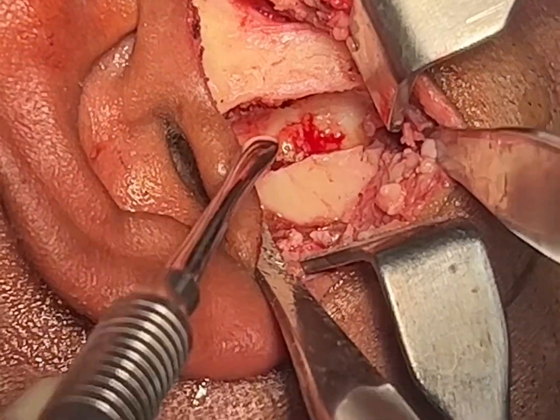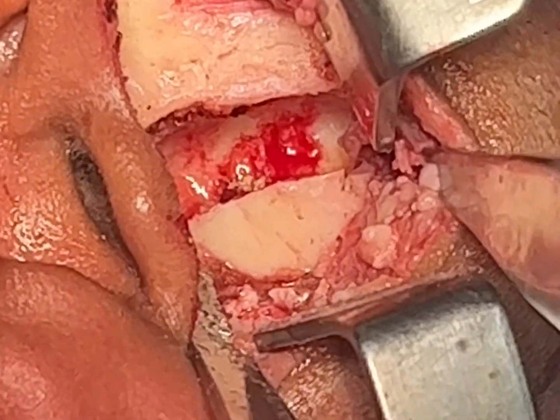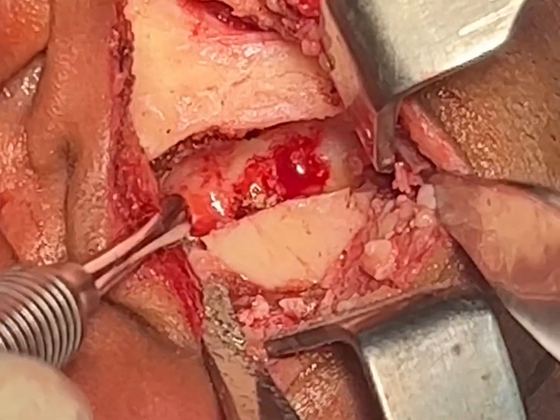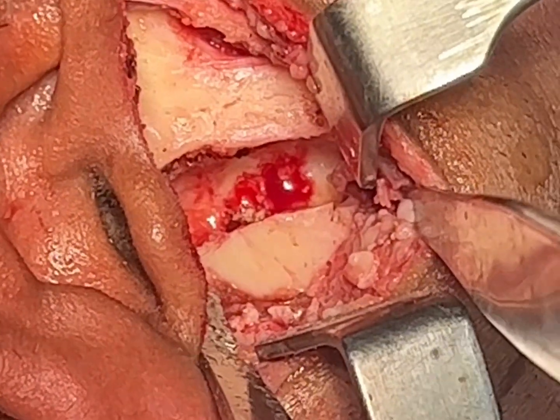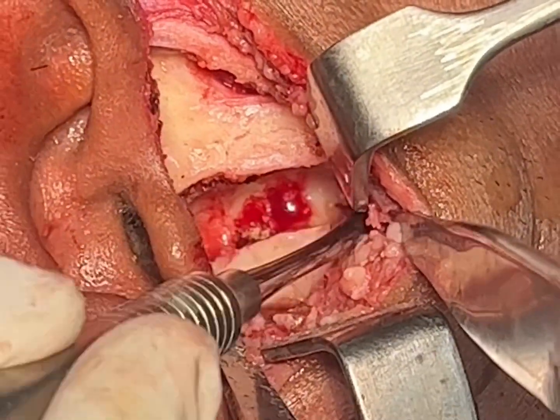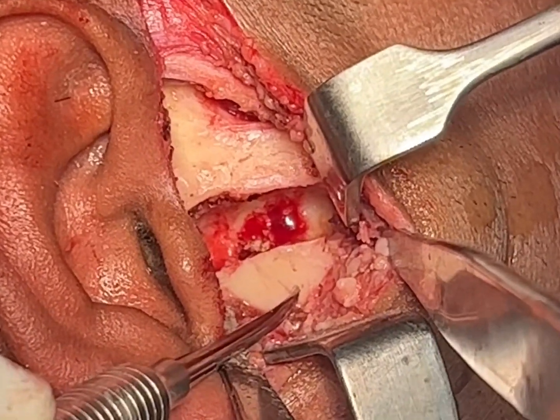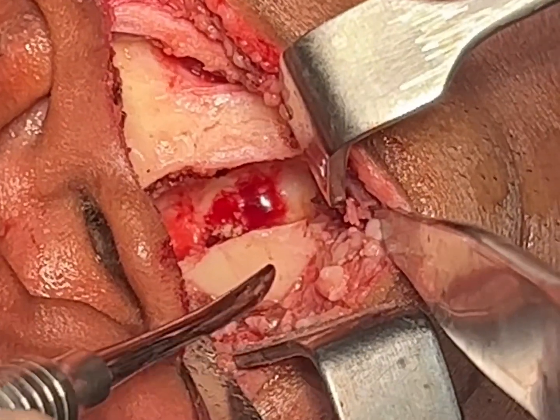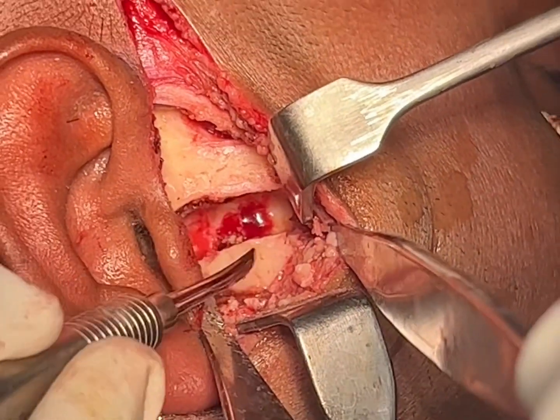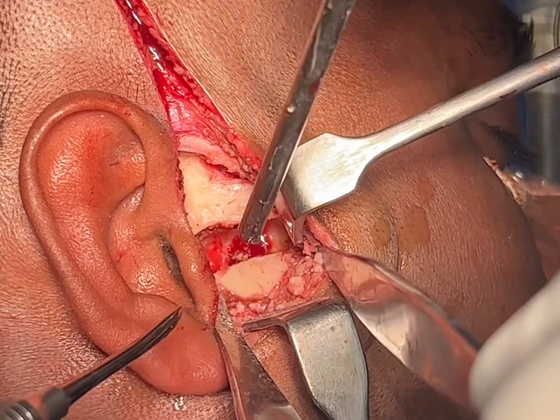We've made a large groove here, going down by 2.5 centimeters, and there's still ankylotic bone for about six more millimeters as per our scan. Once we remove this totally, the remaining part of the lower jaw is going to move freely, as its attachment from the cranial base will be completely detached.